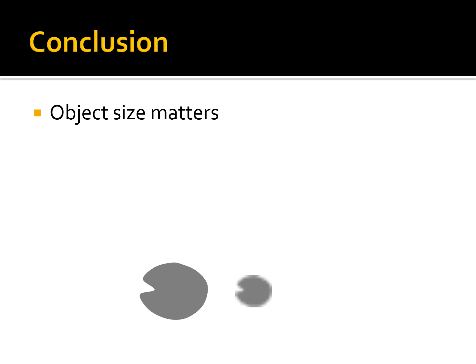Also, imaging plates with smaller pixels will record more detail. This increased detail may not be appreciated unless the image is magnified. Also, radiographers must realize that radiologist monitors will display more detail than do the monitors available to the radiographers.